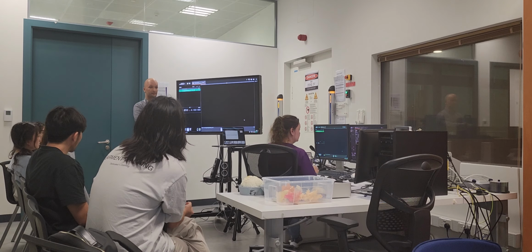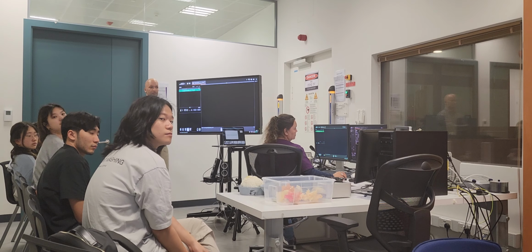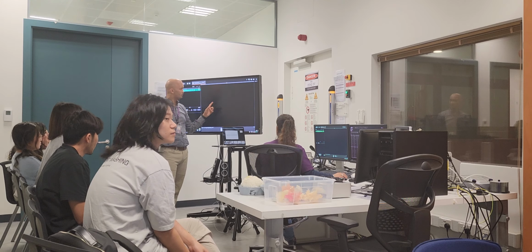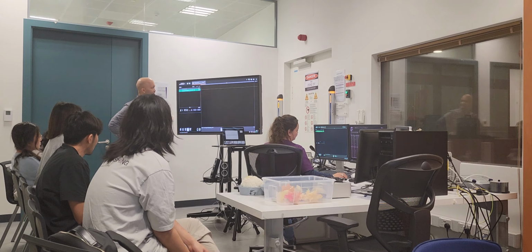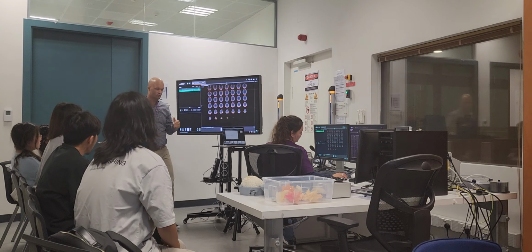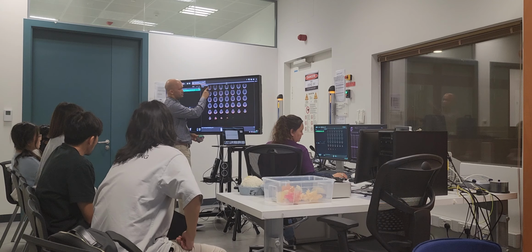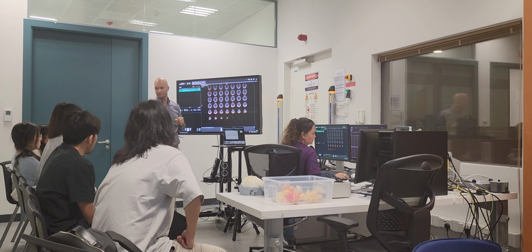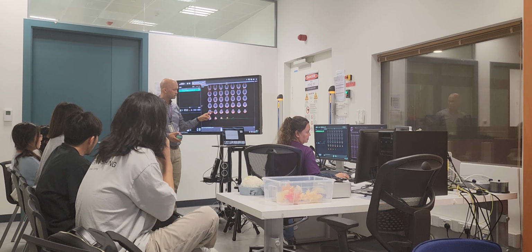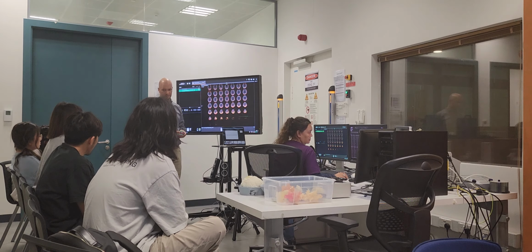Okay, so now he's doing the functional task. See, he has now stop and tap fingers, and we were not going to tell you which fingers he's tapping. Can you load the? I don't need to say anything to him. Okay, so now these are cuts through his brain. You're looking at the top slice is here, the bottom slice is there. Here's his eyes. And you can see functional activation localized mostly toward the top, not exactly the top of the brain, but toward the higher slices of the brain.